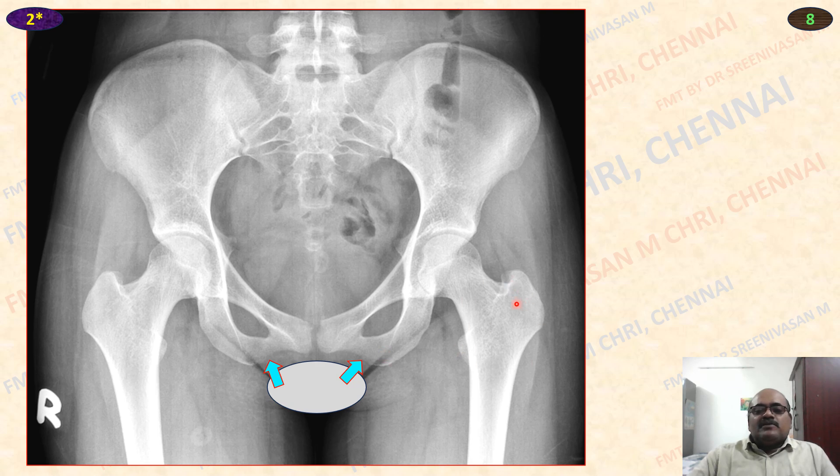So above 17 years, less than 20 years, because the iliac crest is not yet fused. Above 17 years — head, greater and lesser trochanter of femur are fused. 17 to 20 years we can say for this age.